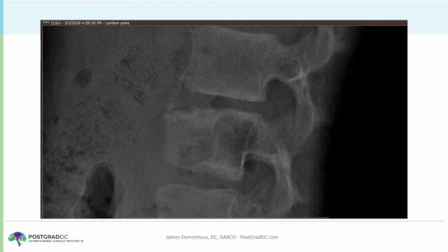On examination, he was quite painful on ranges of motion, and straight leg raise was positive on that side. I decided to send him to the radiologist, and these x-rays were performed. The radiologist called me and said, we have a problem. That L3 superior end plate looks suspicious, possibly a spondylodiscitis. I would recommend MRI with and without contrast. I agreed, and the patient underwent MRI.